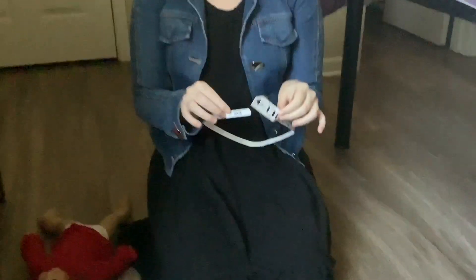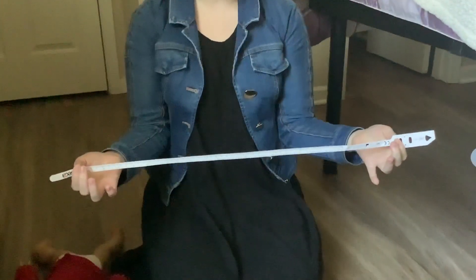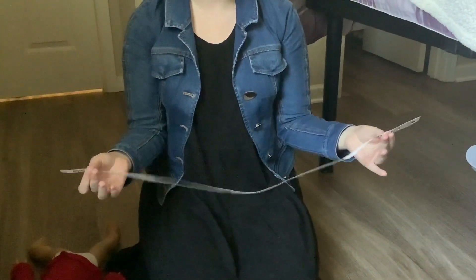This is the UBMCH baby head circumference tutorial. This is the head circumference tape that you should have received in the mail from Dr. Wen.